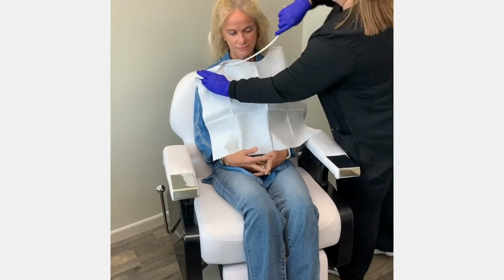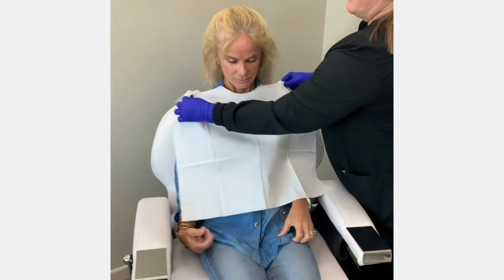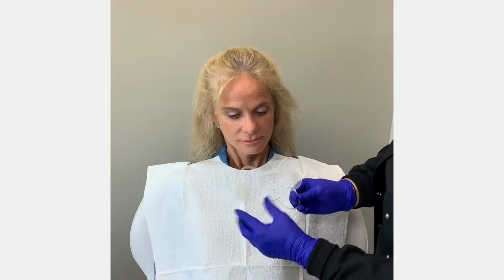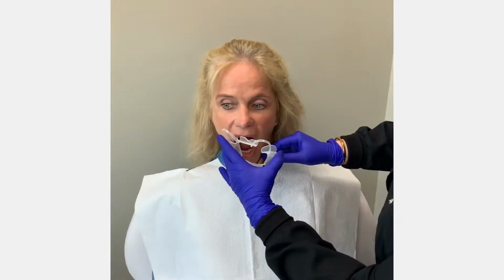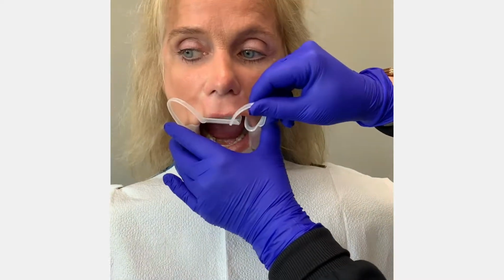A common mistake I see when dentists take a George Gage bite is assuming the patient is going to close into the bite fork exactly like they normally close into centric occlusion. And what I see in my practice is exactly the opposite. Most patients have a tendency to deflect to the right or left when closing into the fork. I'm going to demonstrate how you might alleviate this problem.